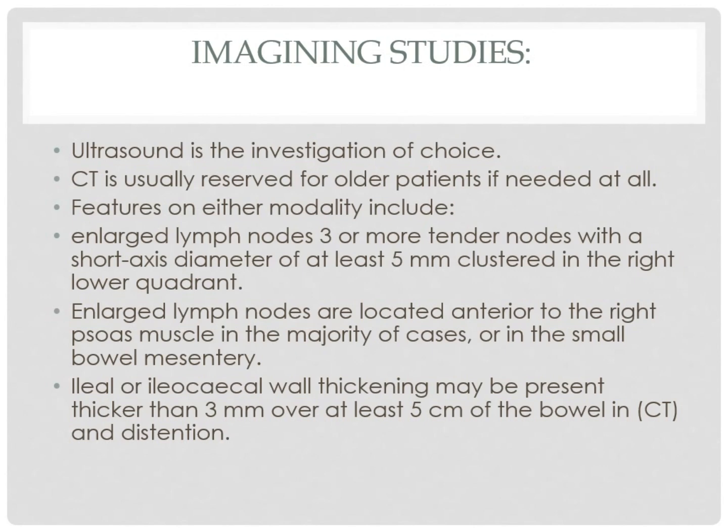This is completely wrong, confusing, would cause a lot of trouble to the patient, to the surgeon, to the treating physician. Never write long axis of a lymph node. You just write, for example, axillary lymph nodes measuring 4 or 5 millimeter in shortest dimension, and that's it. Anyway.